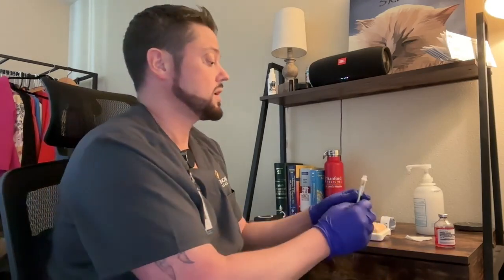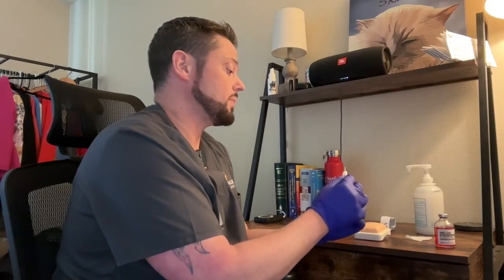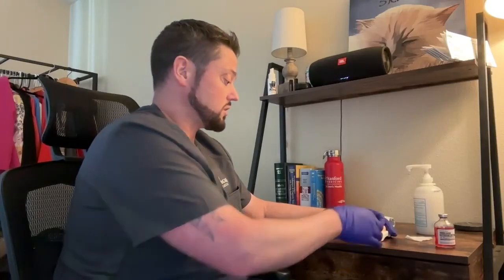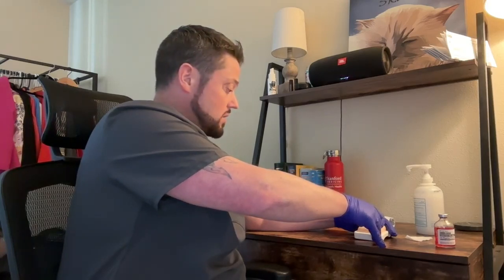Once our site is dry, we're going to take our needle. We want to position it bevel up. We want to grasp it, holding it with our forefinger and our thumb. We want to position our patient's arm, and we want to pull the skin with our forefinger and thumb where we're going to administer our injection. We want to insert our needle at a 5 to 15 degree angle.